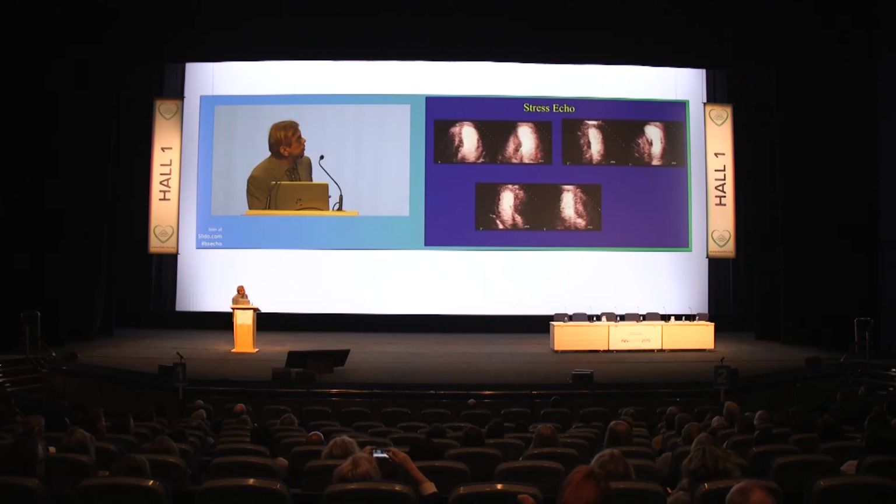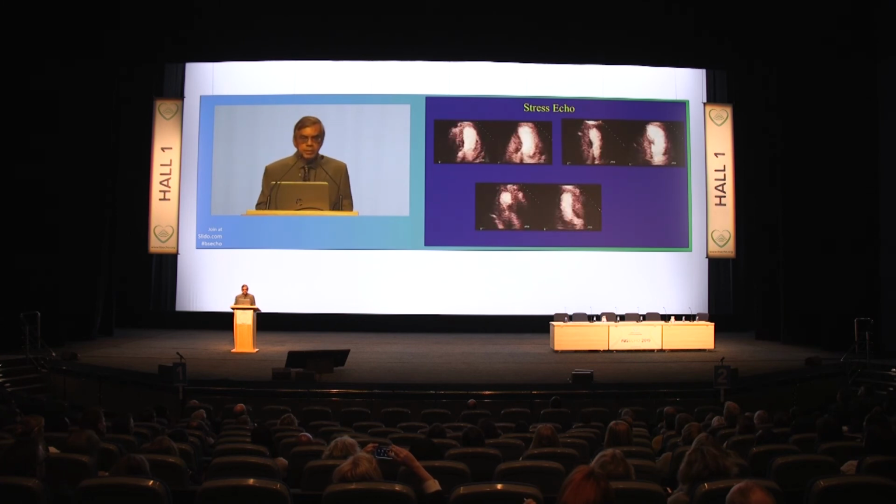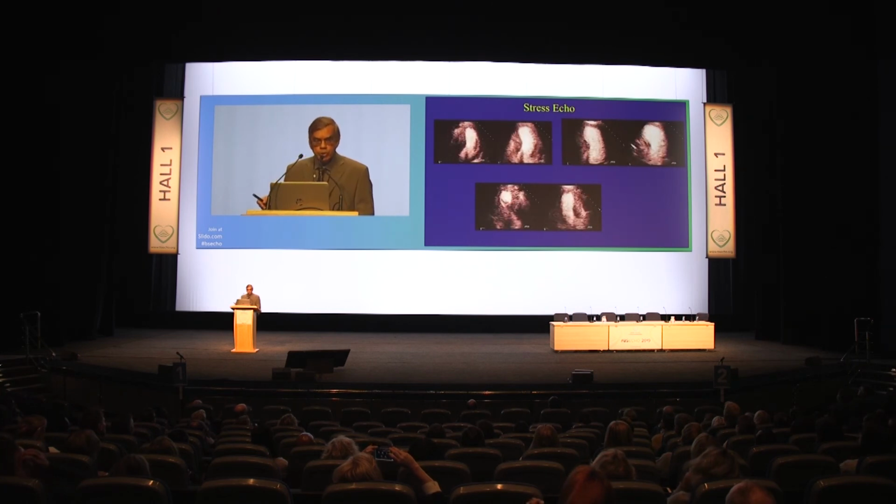At rest, stress, you can see how the apex has dilated. So clearly there is ischemia. Now remember, clearly there is wall motion abnormality. Clearly the apex has dilated. But is there ischemia? Based on this, the patient would receive a stent, because it's causing ischemia, that bridging.